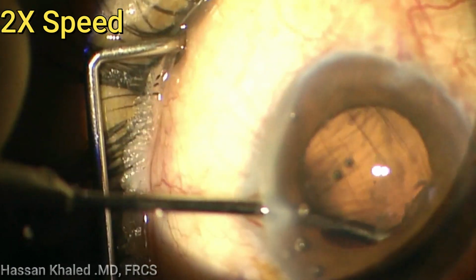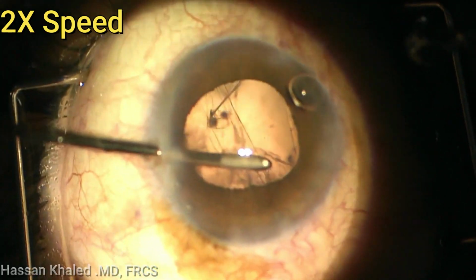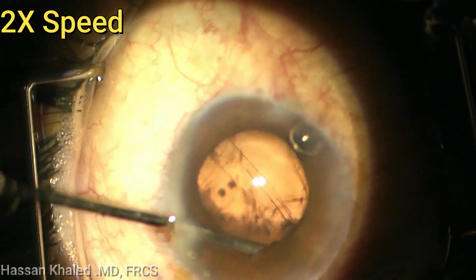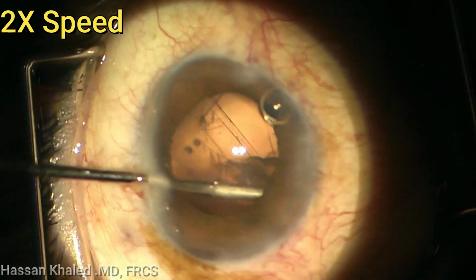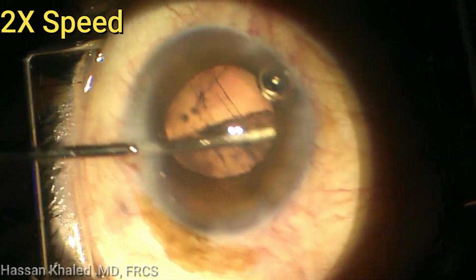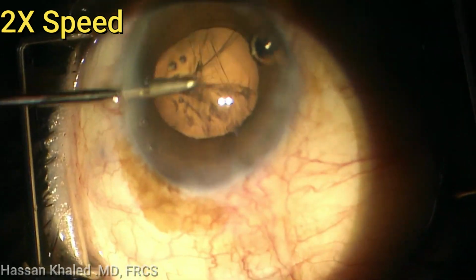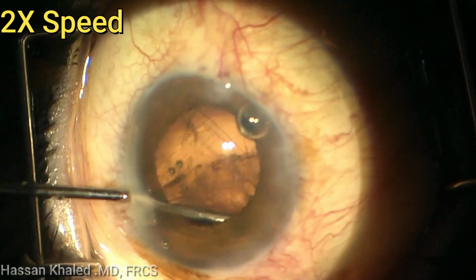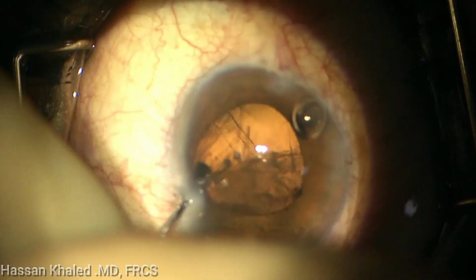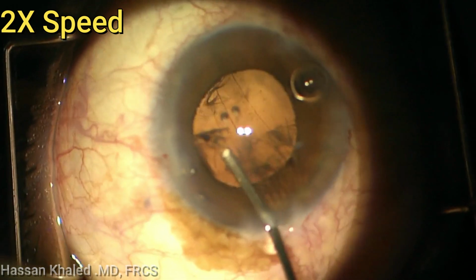Injecting again and removing the cortex from the other side port. I was lucky that nothing was dropped into the vitreous cavity. You can see removing the cortex, dry removal of the cortex. Here actually most of the cortex was removed.